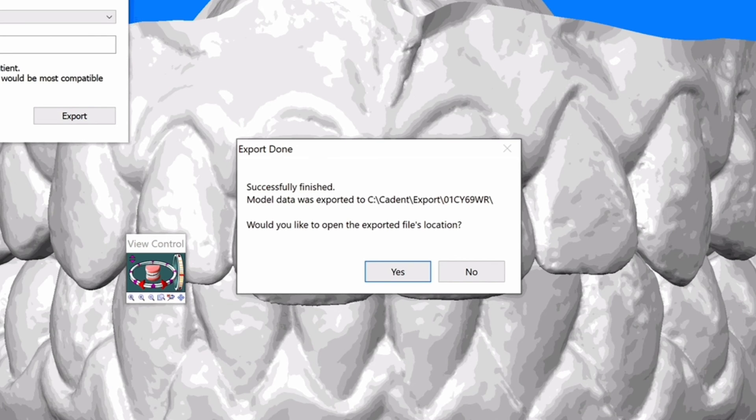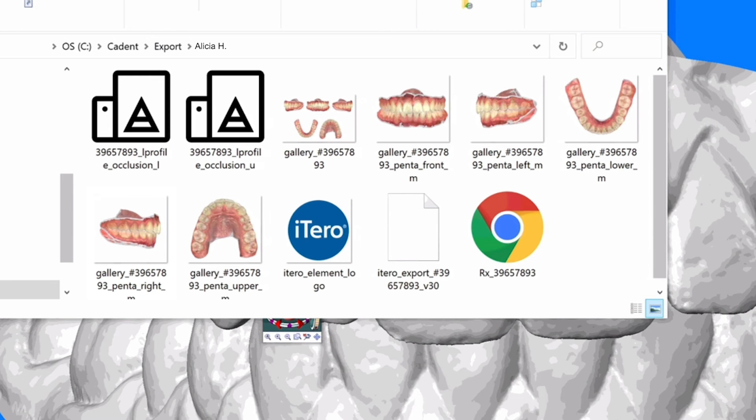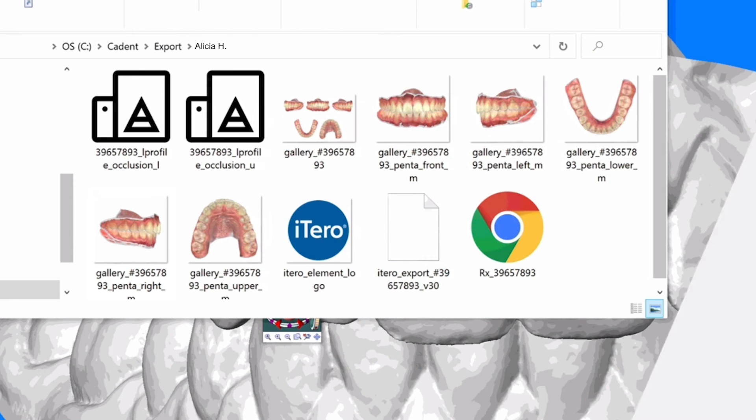A dialog box will pop up asking if you want to open the exported file's location. Select Yes. A window will open showing the folder you created and the files that you can upload into the patient's case in DDX.